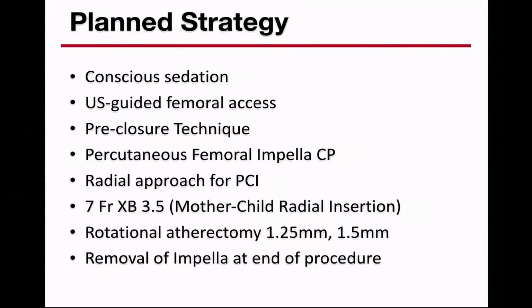So this was our initial approach. This is how we planned it from the beginning. We planned to do it with conscious sedation, no intubation, ultrasound-guided femoral access. We plan to do a pre-closure technique for the Impella insertion. We wanted to use a percutaneous femoral Impella. And for the PCI, we plan to go radial.